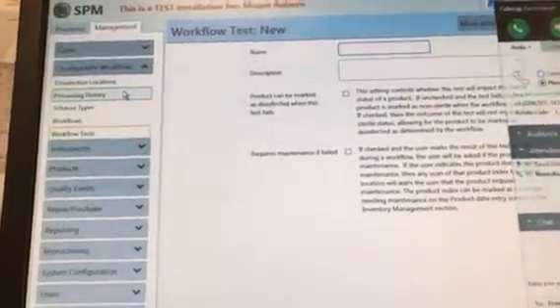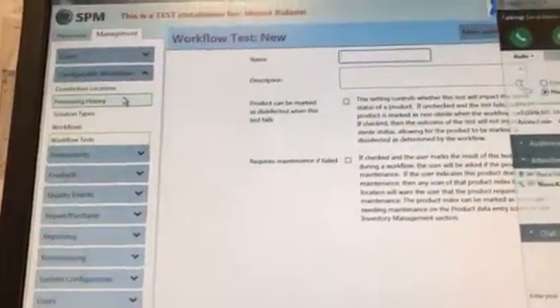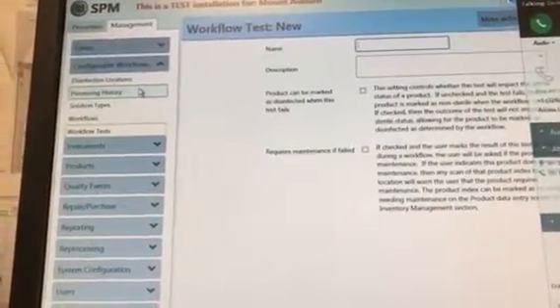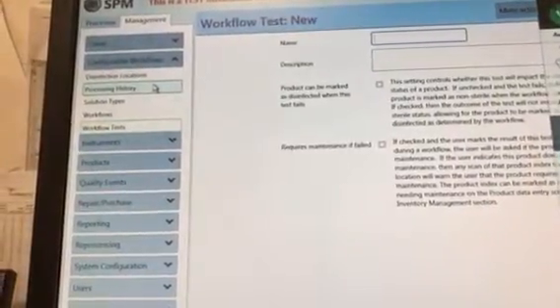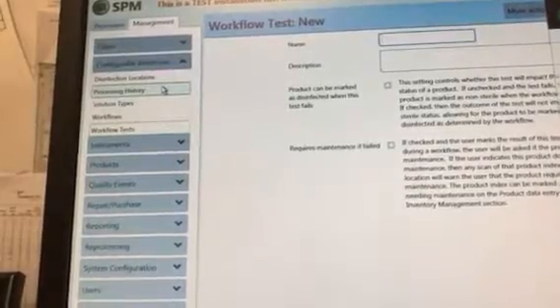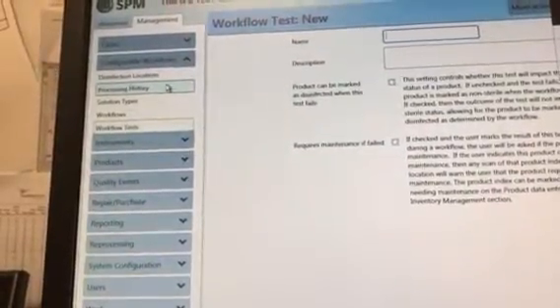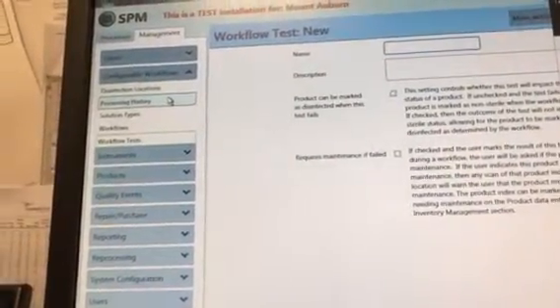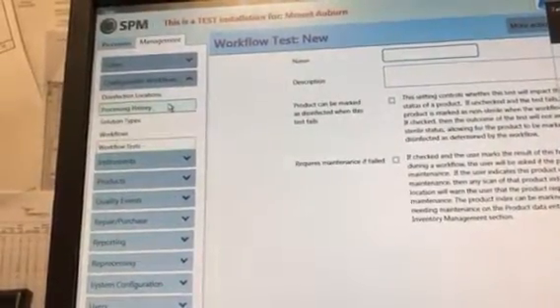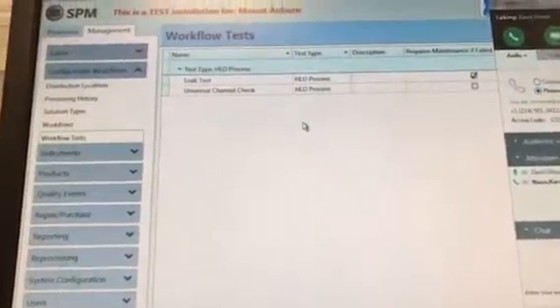Okay. And that's different than, let me ask, on the peracetic acid, when you open the bottle and you put it in there, do you use a test strip to make sure that it passes the minimally effective concentration test? Right. If it doesn't change, it means that the peracetic didn't work, that there's something failing in the peracetic. And is that the test that we're talking about, or are we talking about a different test? Nope, that's the test that we're talking about. That's the test. Okay, perfect. Okay, so we don't need a test type here because we'll handle that in the workflow.